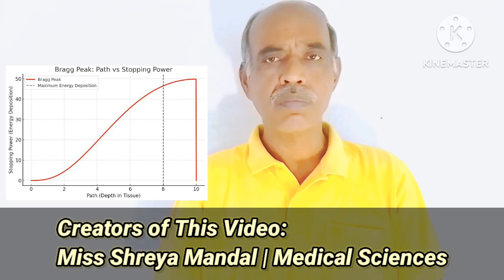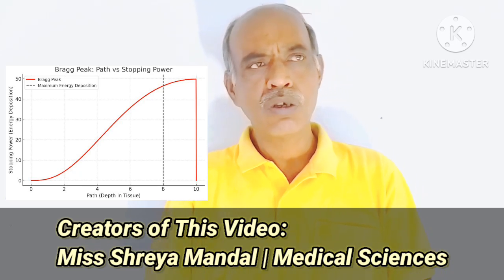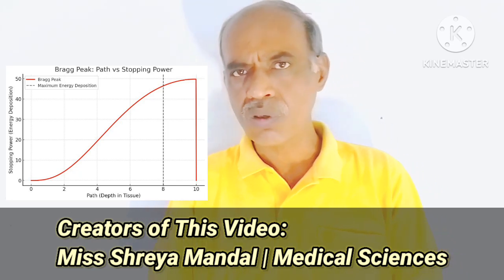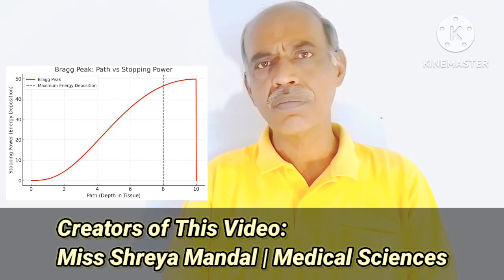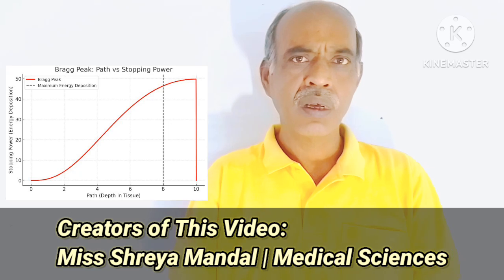How? The reason behind this is the Bragg Peak phenomenon. So, what is actually done in the case of proton therapy? In proton therapy, a high energy beam of protons is sent into your body.